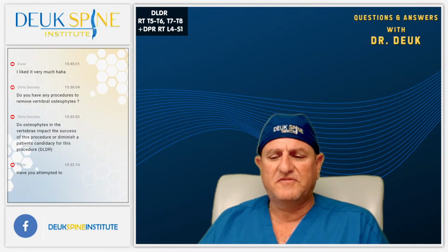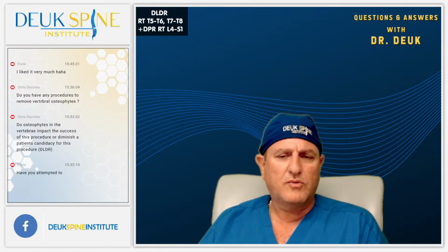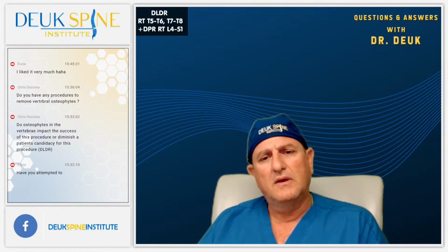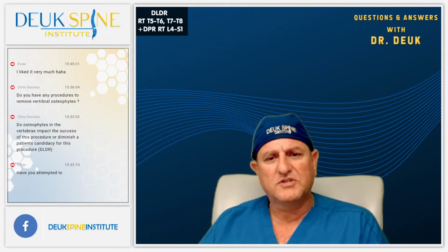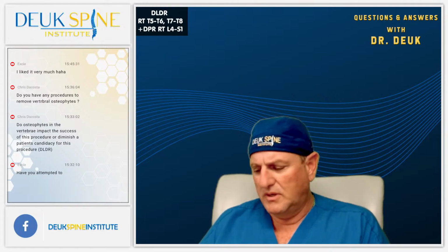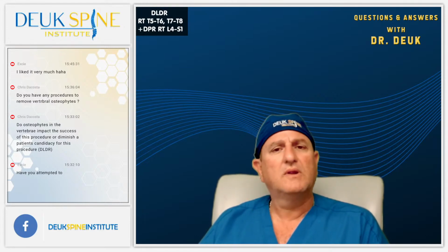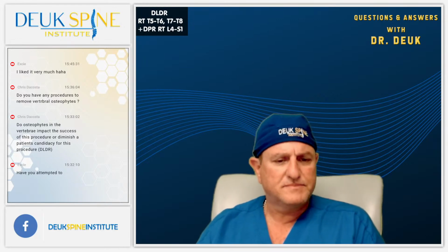And are patients with the osteophytes still candidates? Yes, you are. Absolutely. If there is an osteophyte, and by the way, there was one in this patient, a small one, and I zapped it away with the laser. If you go back and watch it, it was on the left-hand side. It was like a little bony bridge. Long story short, it doesn't matter if there's osteophytes, the surgery still does the job.